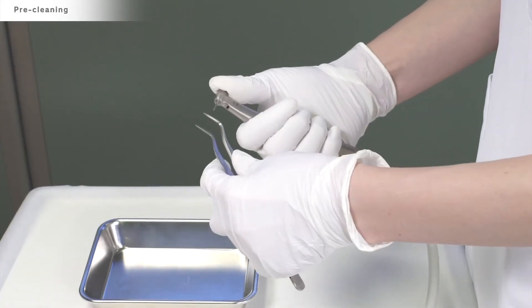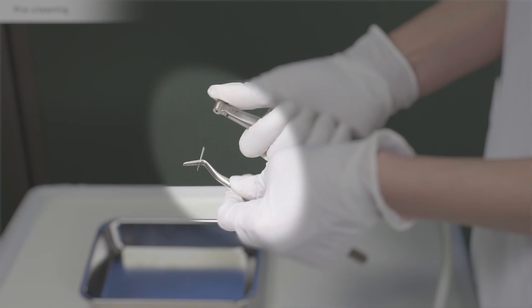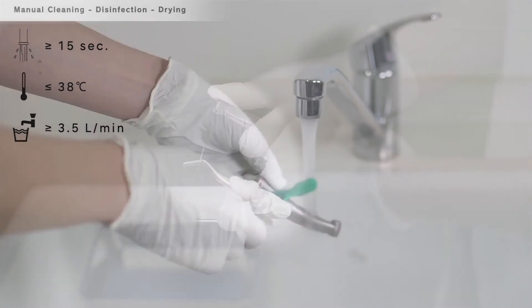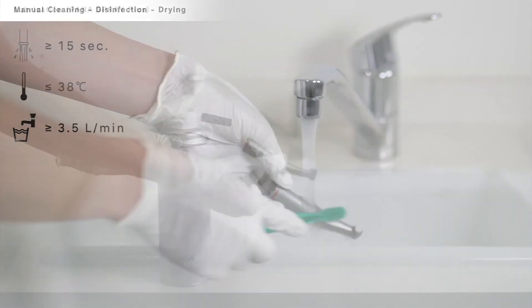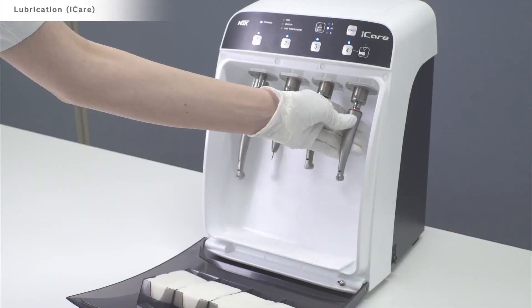Always ensure your burrs are sharp, as blunt burrs will affect the cutting efficiency. When the procedure has ended, it's important to remove the burr immediately after use and prior to removing the handpiece from the motor. Always process the handpiece immediately after use and follow NSK's reprocessing guides for cleaning, lubricating and sterilisation.